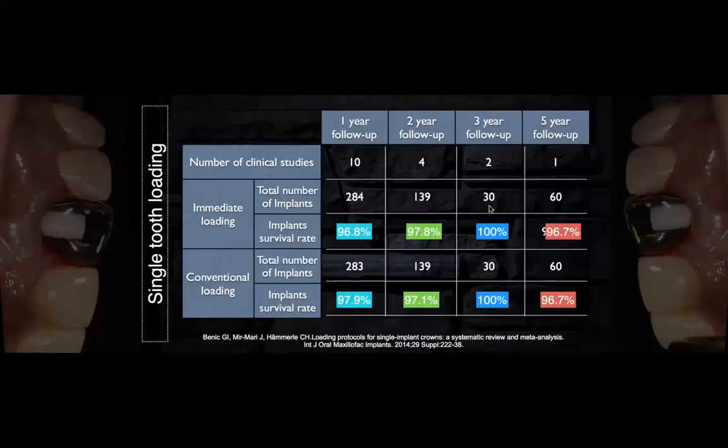So I want to bring your attention to, I don't want you to take a look at the entire arch. This is a little bit too busy, okay? But this is talking about the immediate loading versus conventional loading. And then on top, you have 1 year, 2, 3, and a 5-year follow-up. Now take a look at the implant survival rate on an immediate loading, and take a look at the implant surviving rate on the conventional loading.